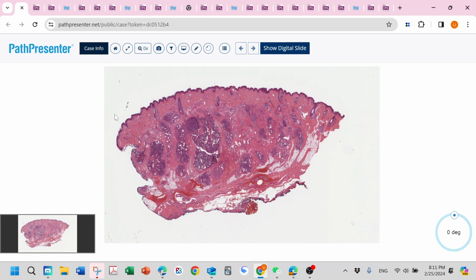Okay, next case. This one is infantile hemangioma. Usually we rarely get a biopsy sample of this type of lesion because from the history, the clinician usually knows that it's infantile hemangioma. For the clinicopathologic findings, this lesion happens in the first few weeks of an infant, and they usually involute spontaneously. So for this hemangioma, when you biopsy, you may have two phases.